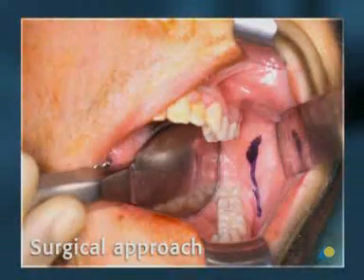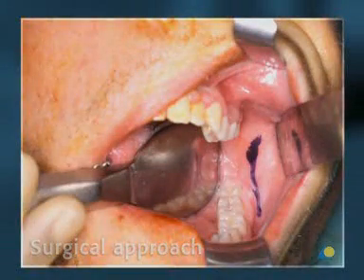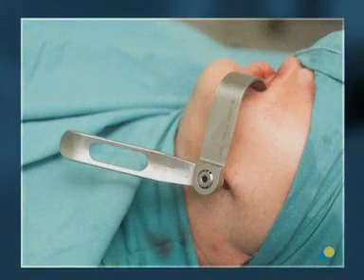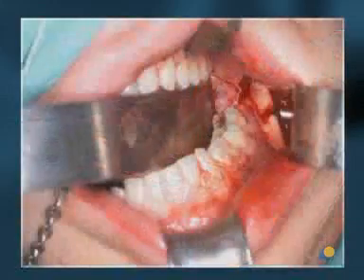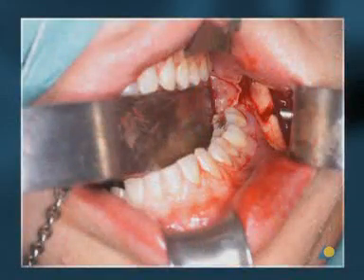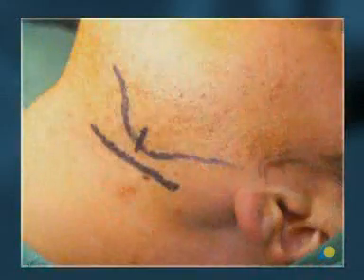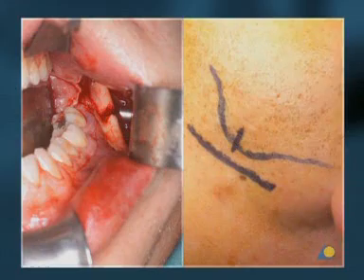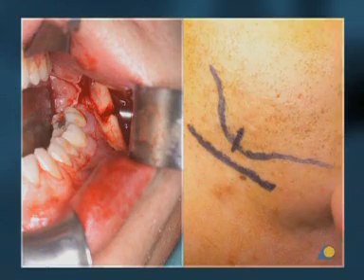The surgical approach can consist of an oral approach with the assistance of transbuccal instrumentation, an external approach, or a combination of an oral and an external approach.